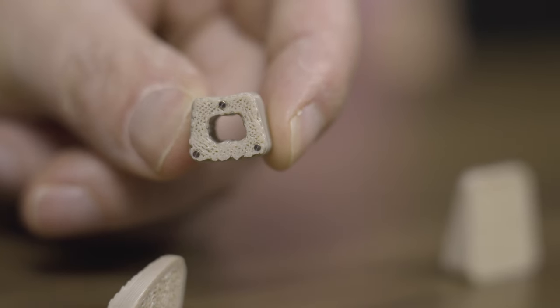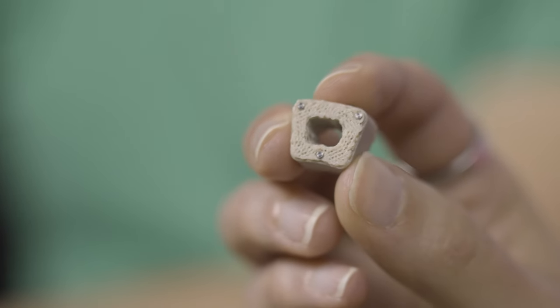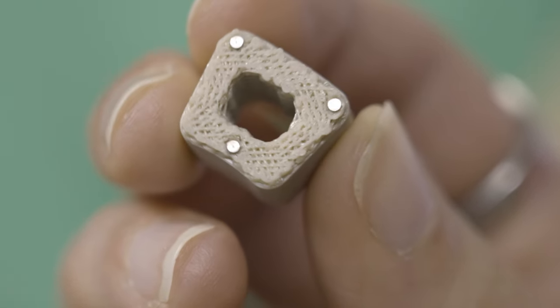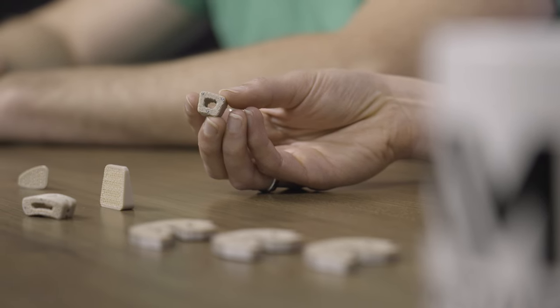The first implant has gone through FDA approval, cleared FDA approval. It took a while, not just because the material is different, but also because the process is so different. But now that it has been approved, there is a pathway for future 3D printed PEEK implants.